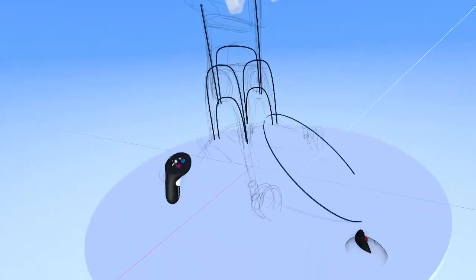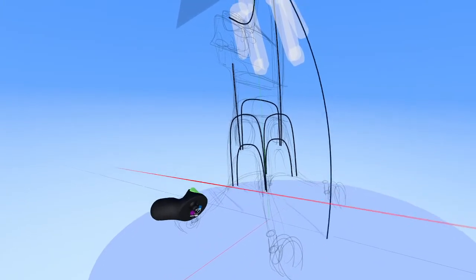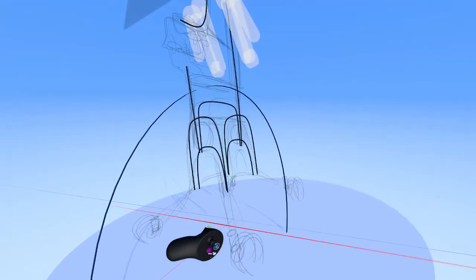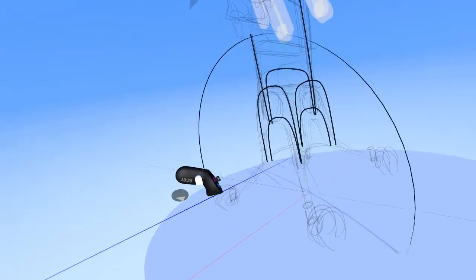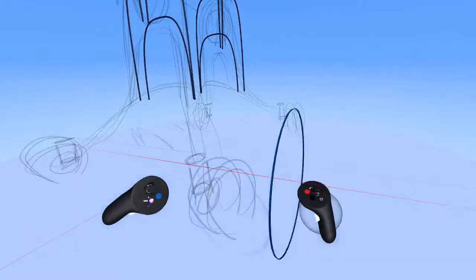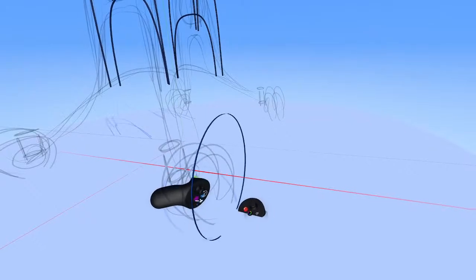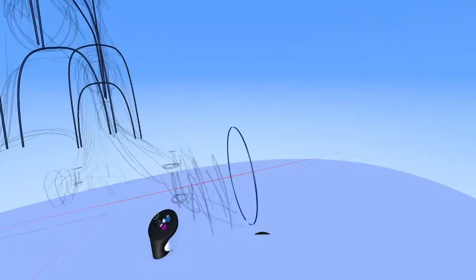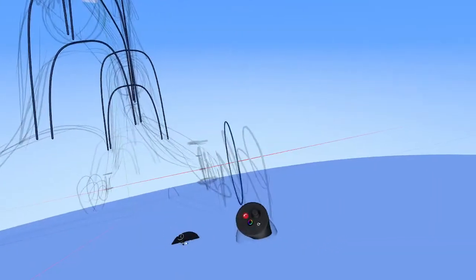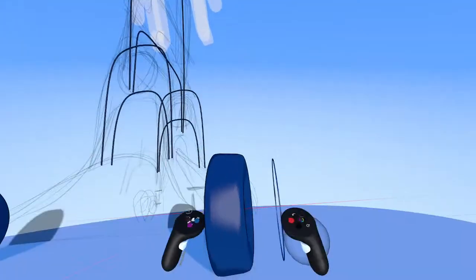So no problem, you can do that. Hold in the pointer finger trigger halfway, so feather hold the trigger, and rotate it in the direction of the axes that you want to snap to. So in this case, I'm snapped to X, and I'm just going to hold it and move it to the location I want. And then once I have it there, I'm just going to make that loose sketch. Again, I can never make that perfect sketch line, at least me. So I like to make a loose shape like this.